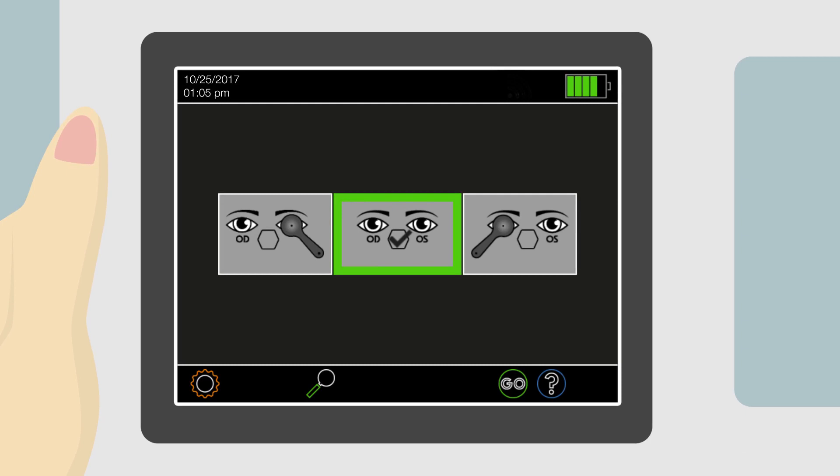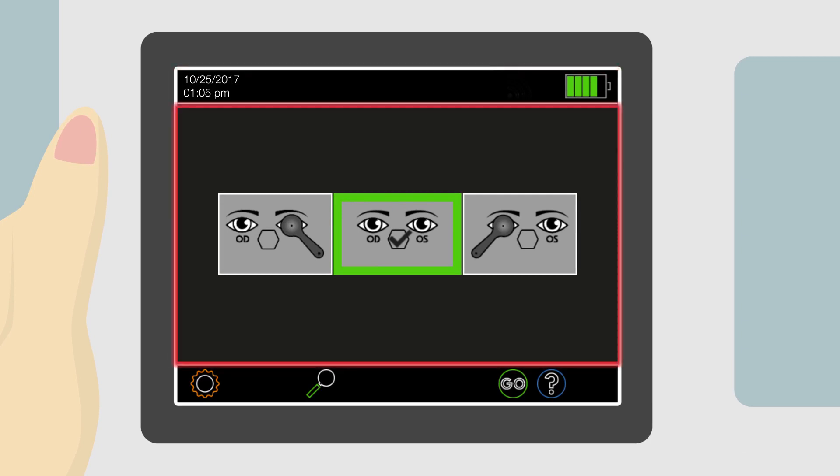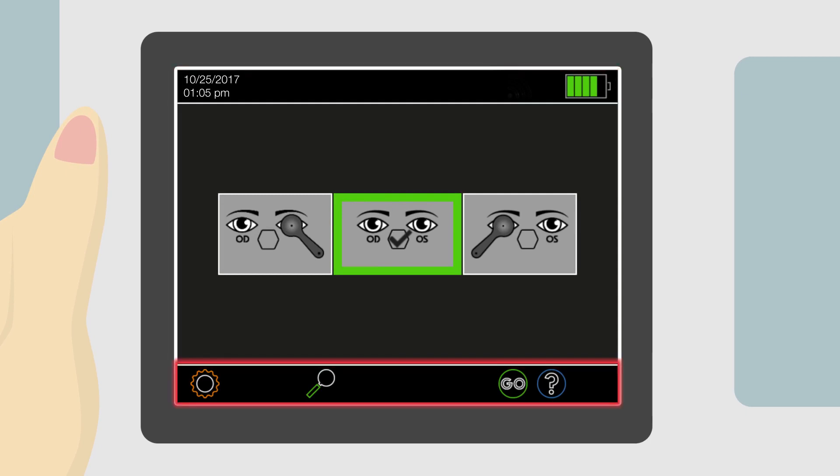The screen is composed of a header bar, an information section, and a navigation bar.